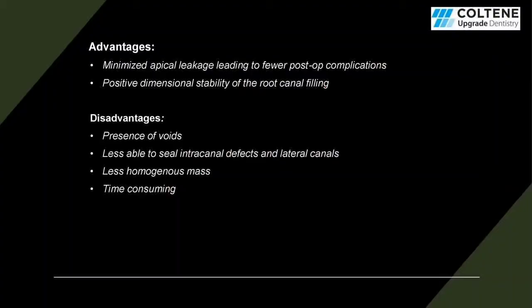The primary advantage of this method, apart from its simplicity, is that it has a very minimum chance of apical leakage, which is obviously very important because we don't need fluids and sealers percolating into the apical area. Other than that, it provides a positive dimensional stability. The disadvantages include the presence of voids, because since we are doing it mechanically without any thermoplastic techniques, the penetration of the material into the lateral canals and tiny canals will be minimum. If not absent, it will be very less.